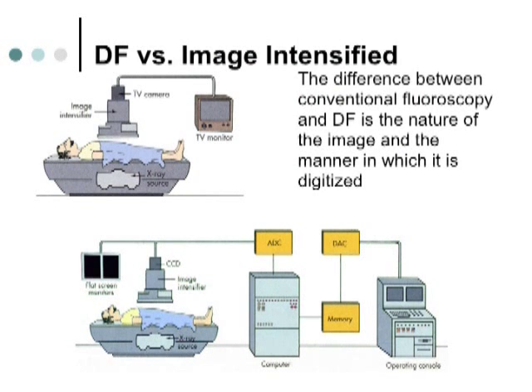Okay, so what's the difference between conventional fluoroscopy and digital fluoroscopy? Well, the biggest difference is the first conversion, just like we went from film screen to CR to cassettes, right? The first generation, the main difference between the two systems is the camera right here. Instead of the television camera, we have the CCD, which we said was what? Charged couple device. The charged couple device.